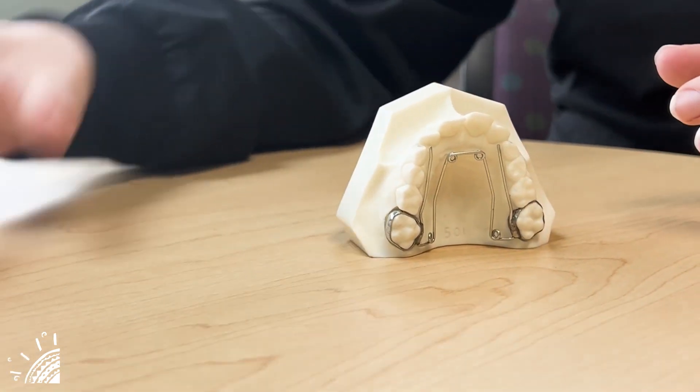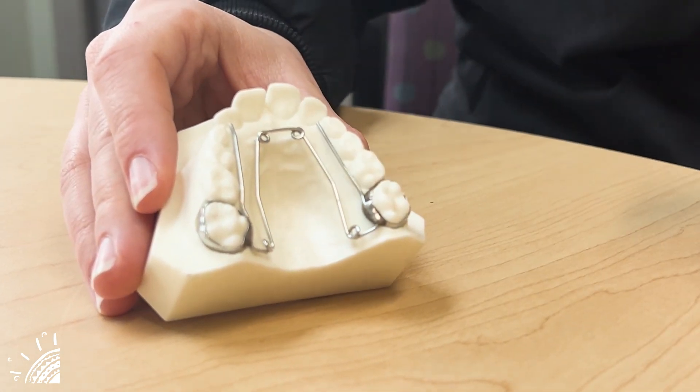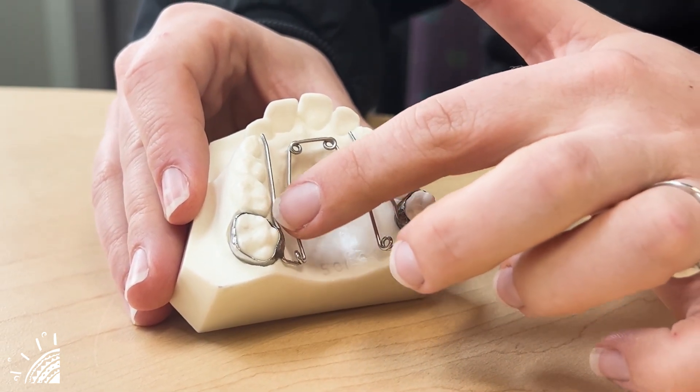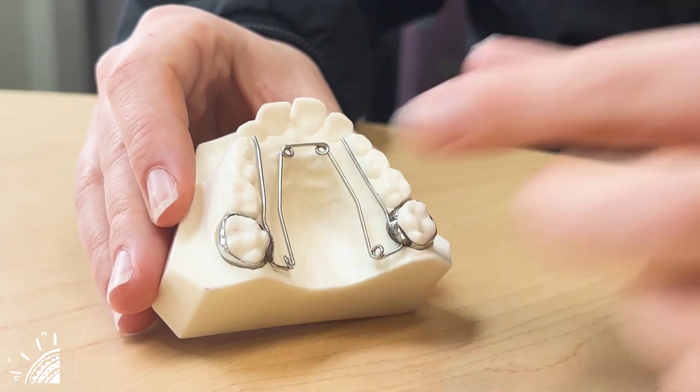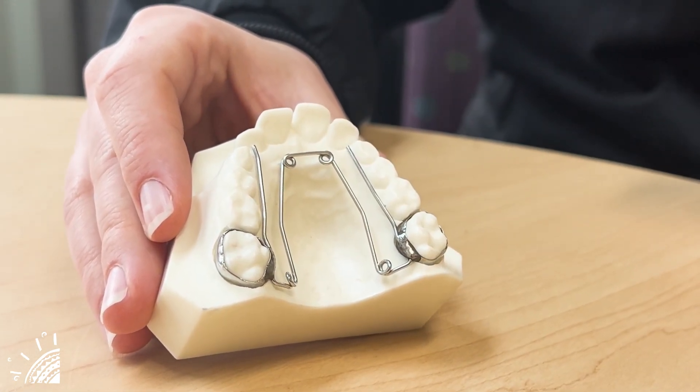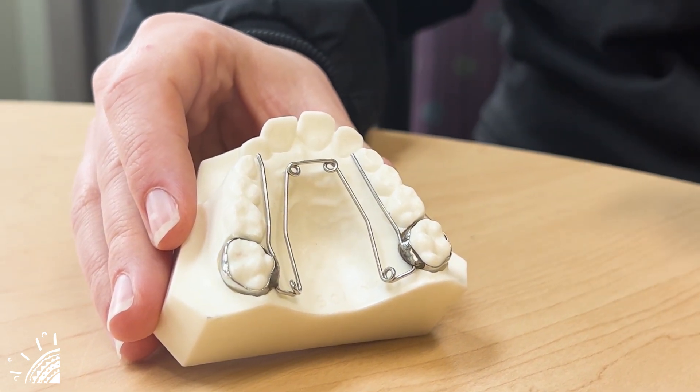How this appliance works is there are some springs — four springs on the expander — and they activate these bars or arms here on the side. These arms apply a light pressure to the sides of the palate, slowly expanding it with time.